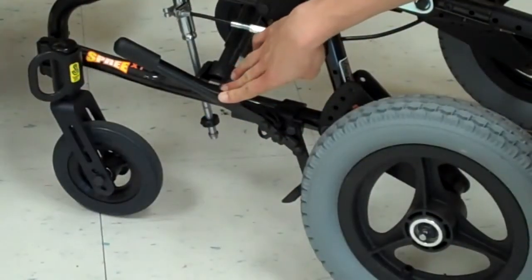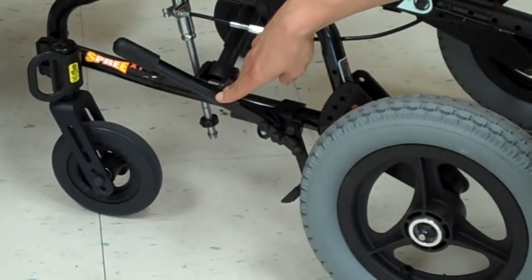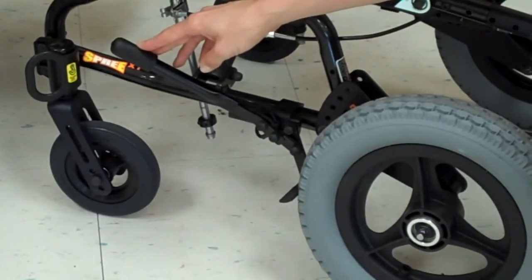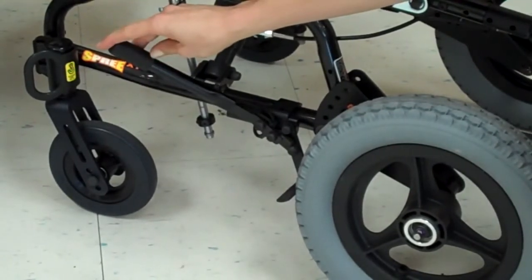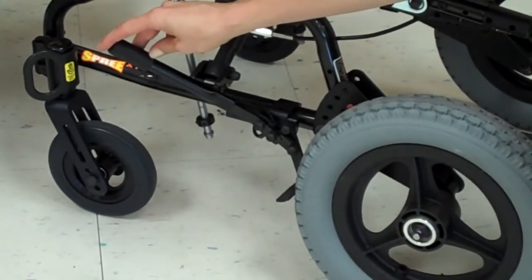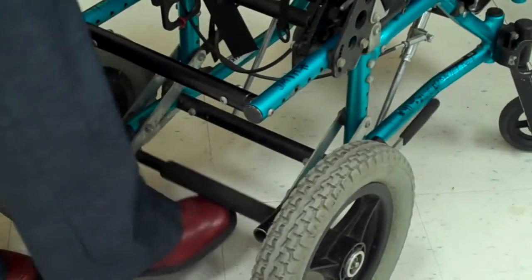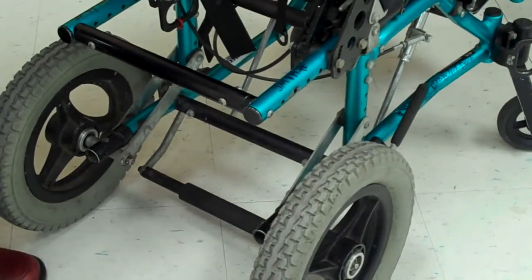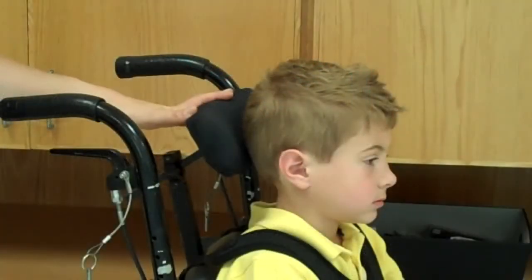These are the wheel locks. The purpose of the wheel locks is to stop the wheels from moving. This is used during transfers, when a student is positioned at her desk, and when parked. There are a variety of wheel locks. Some wheel locks push to lock, some pull. It is important that the locks are working properly in order to ensure the safety of our students. This is another type of wheel lock. You use your feet to lock and unlock the wheels. It is important to remember with wheel locks that both wheel locks should be engaged when the chair is not moving.